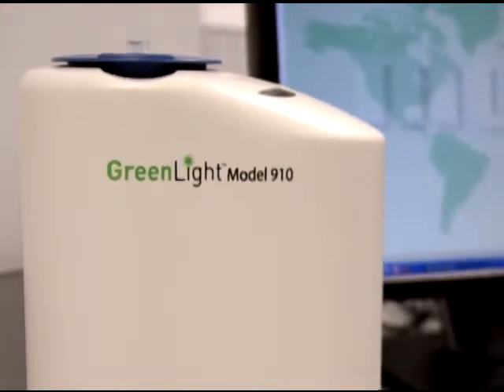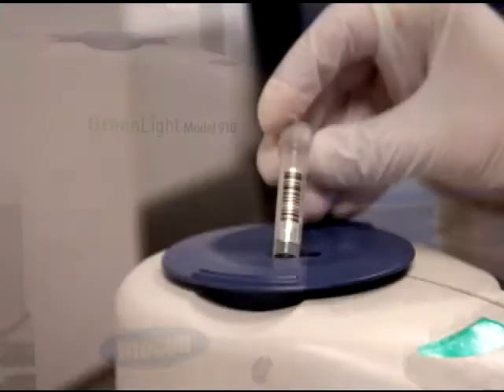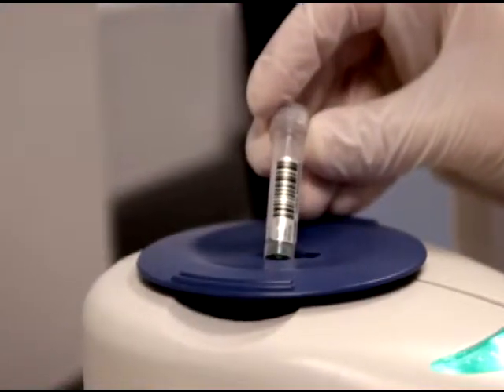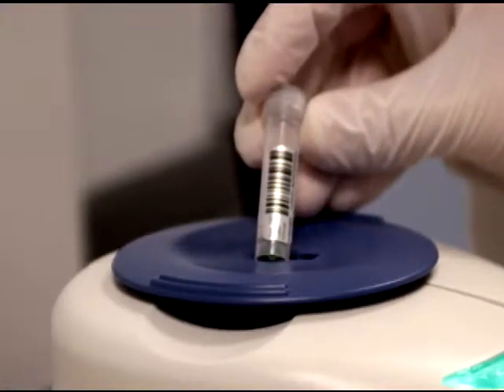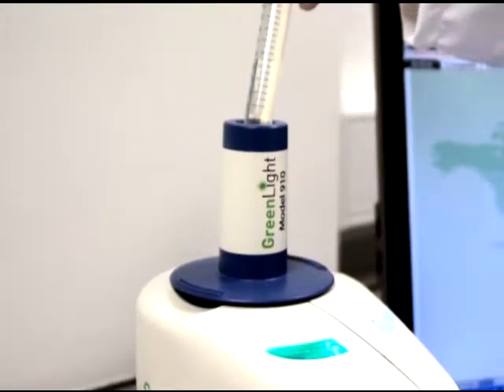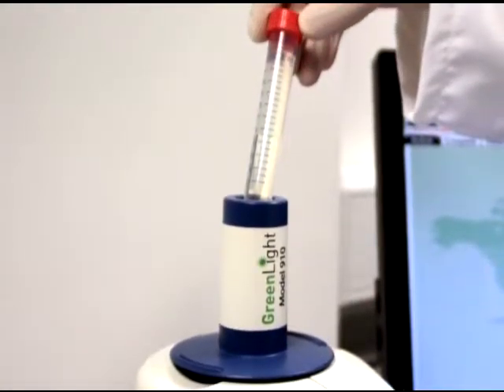The Greenlight 910 is the little brother of the 960. It is capable of using two different size vials. The 1.5 milliliter vial is used for food homogenates. The 15 milliliter vial is used for environmental hygiene swabs and dairy samples.